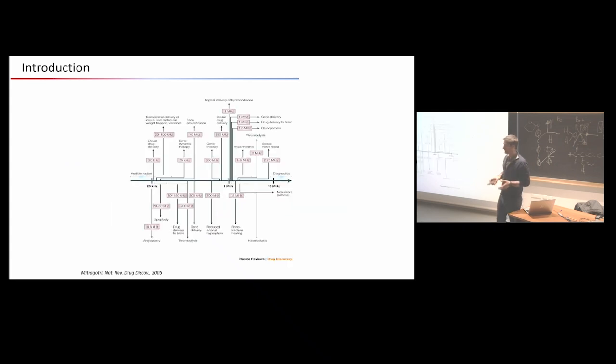For therapeutic application, it's quite different from what you are going to use for imaging. For example, Jean-Luc showed imaging mostly between 5-15 megahertz. That's the frequencies that are currently used in clinics. Here for therapy, we use very low frequency, much lower frequency. Do you have an idea why or not? Yeah. To increase the penetration, that's the first point. To penetrate, for example, the skull, that is not possible at high frequency or very, very difficult to do.